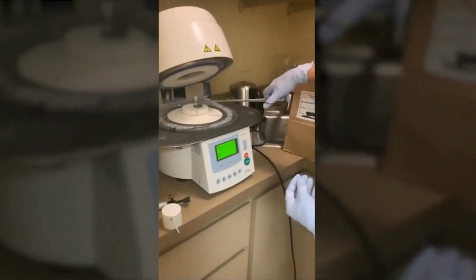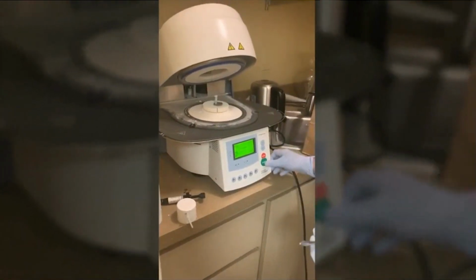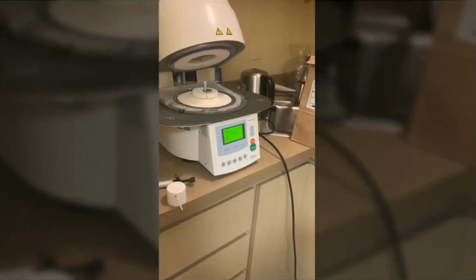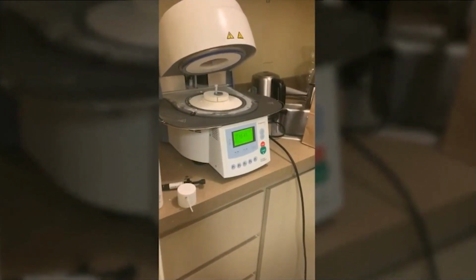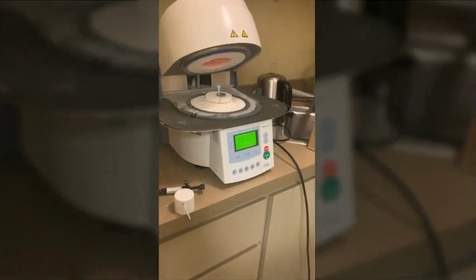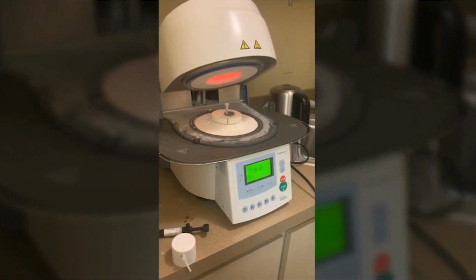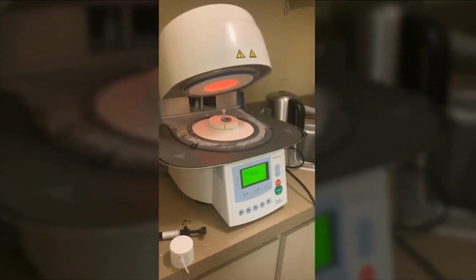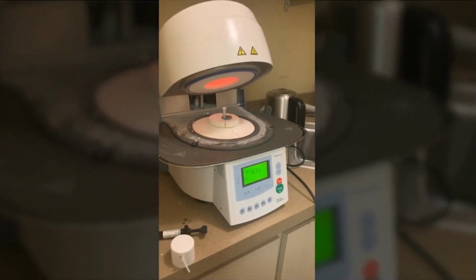So here we are putting it into the oven. And again, my assistants do all of this. Once it goes to the milling unit, again, I'm off doing hygiene checks, paperwork, working on another patient, or working on the same patient, just maybe on a different tooth in the mouth. And so once that gets going, you see it gets bright red, that will eventually close. You just leave it be.